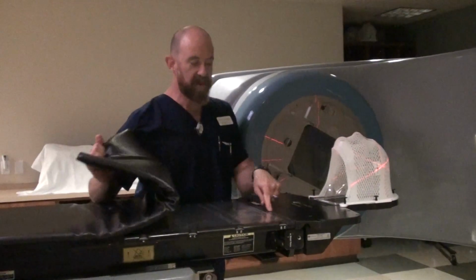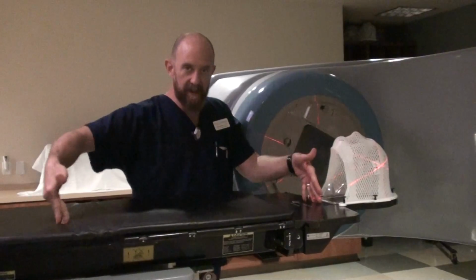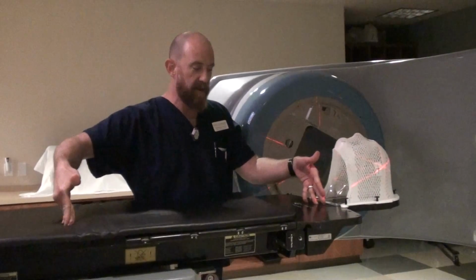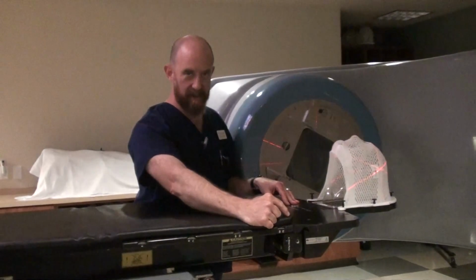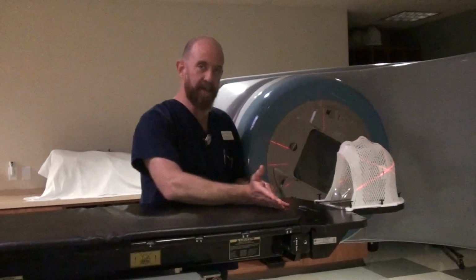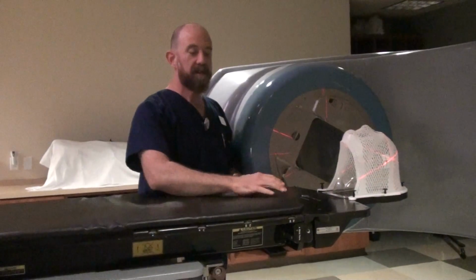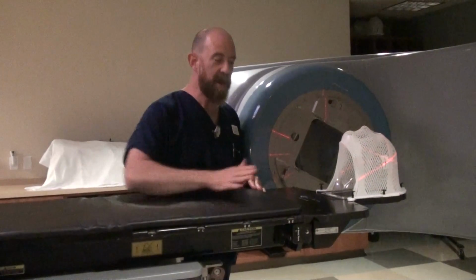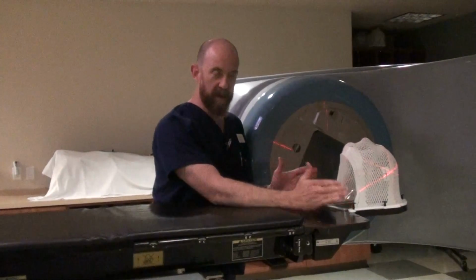So I use this line as a delineating factor. There's also an overlay that you can use that comes from Civco. It's actually got a line painted on it. That line is for the table pad to stop, and it corresponds with the same position. So make sure that your table pad is not too far up on the table and thus interfere with your setup.